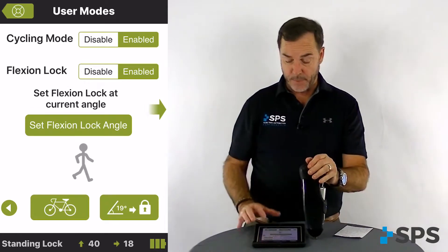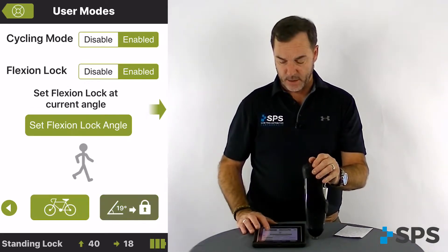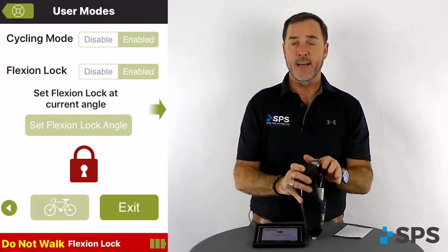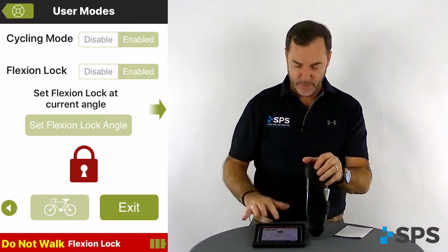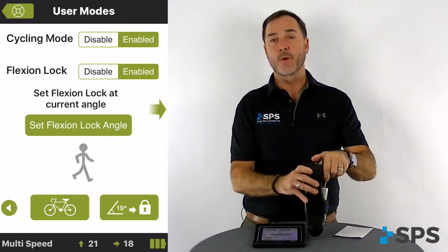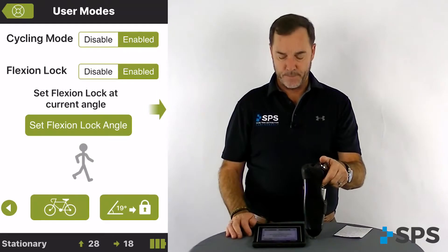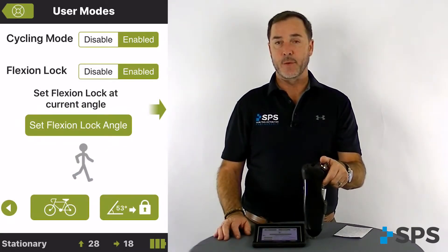Exit. By depressing the flexion angle button, we can actually test the flexion angle lock. Press ok, and you'll see that the knee now will not bend past that determined angle. If that needs to be reset, press exit. Bend the knee to the appropriate angle you would like to try, set flexion angle lock, press ok, and you can see the new setting is now 53 degrees.